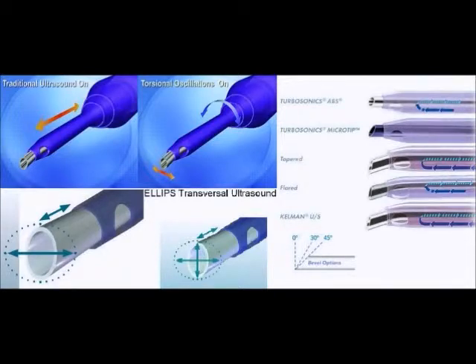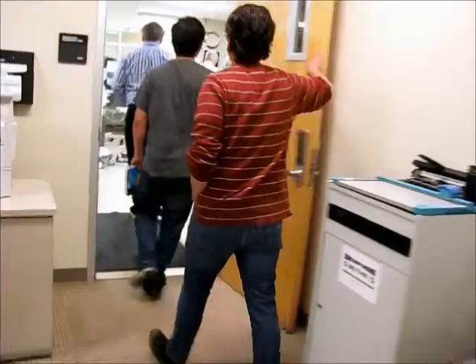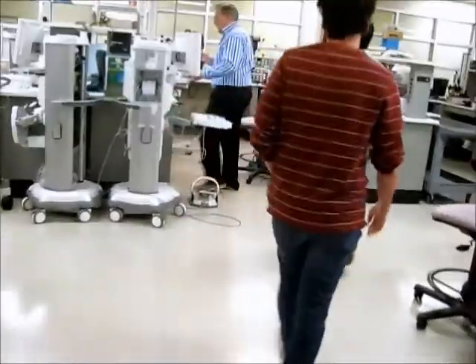Our design focuses on the tubing used by the phacoemulsification machine. It is well known that stiffer tubing will decrease surge through the system. We hope that by exploring different materials with varied thicknesses and properties, we can find one that will provide the best performance in decreasing post-occlusion surge.